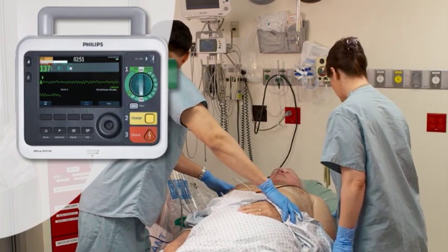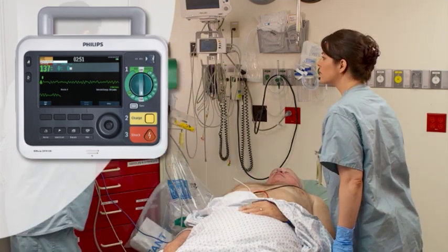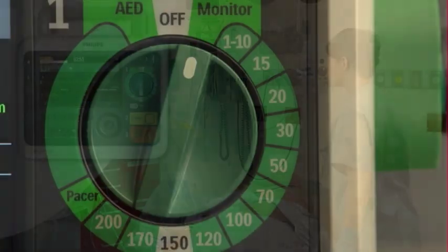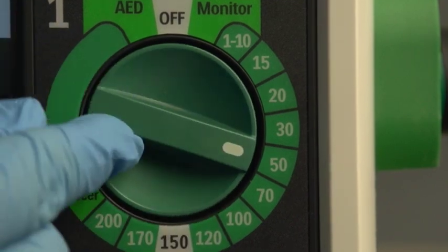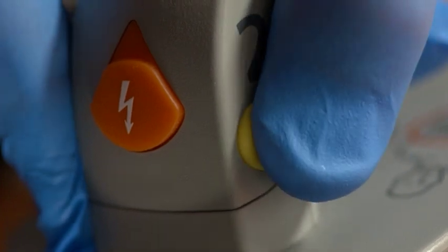After assessing your patient and determining that defibrillation is necessary, connect the paddles cable to the device. Set the therapy knob to the desired energy for the patient, and apply the paddles to the patient's bare chest.